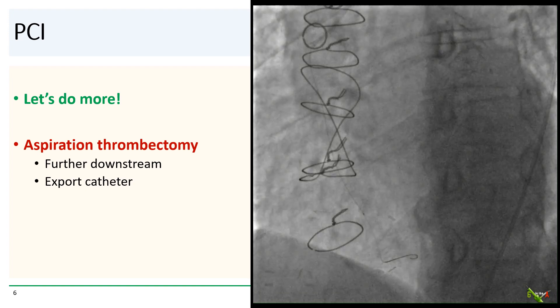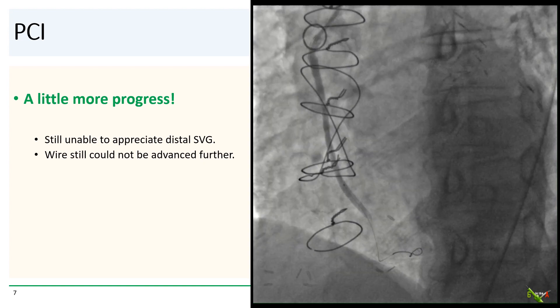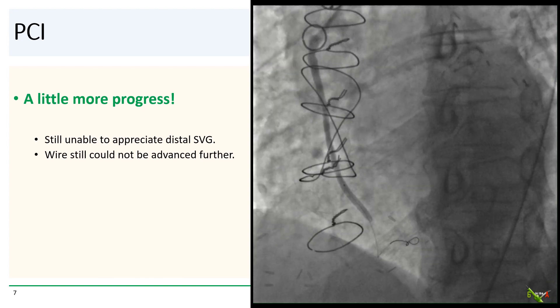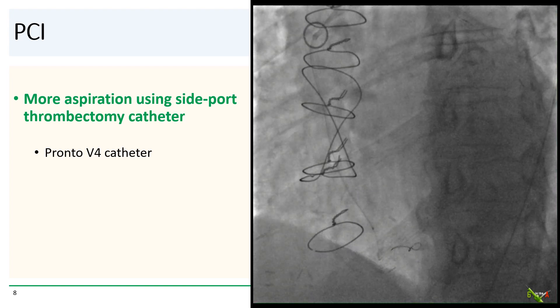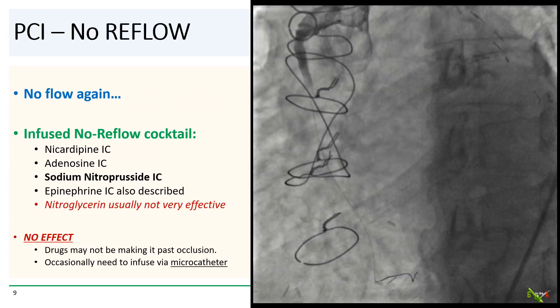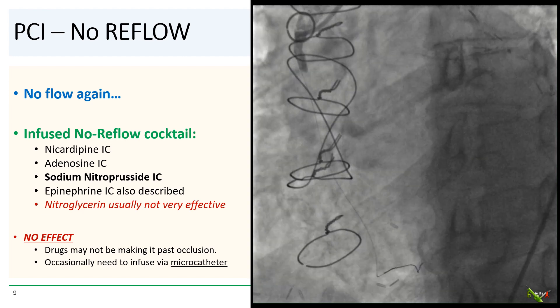We did a little more aspiration thrombectomy, this time further downstream in the graft, making a little more progress with contrast penetrating even more into the SVG. But we still could not appreciate the whole SVG, and the wire could not be advanced any further. We then used a PRONTO V4 catheter, which has the aspiration port on the side rather than at the tip, hoping that the different orientation might allow more or different clot extraction. But after this third run of aspiration, flow was actually worse — some of the thrombus may have embolized downstream.